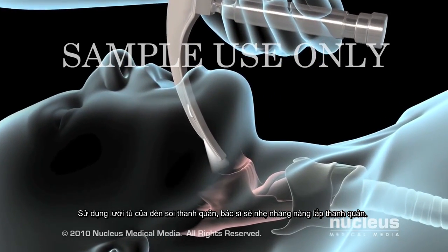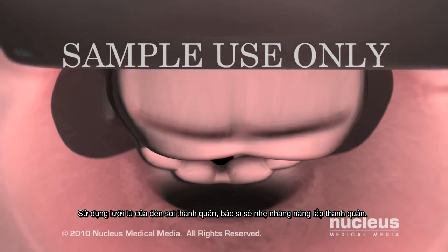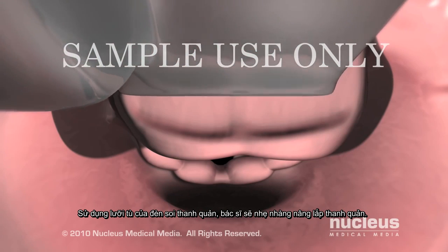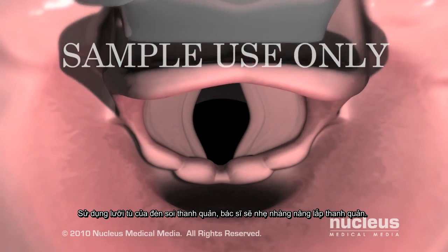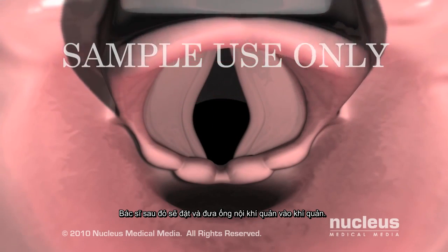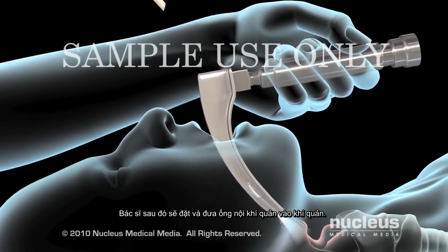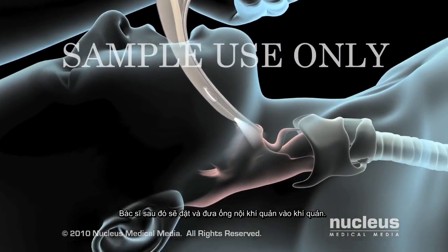Using the blade, your doctor will gently raise the epiglottis, which is a flap of tissue protecting your larynx. He or she will then advance the tip of the endotracheal tube into the trachea.